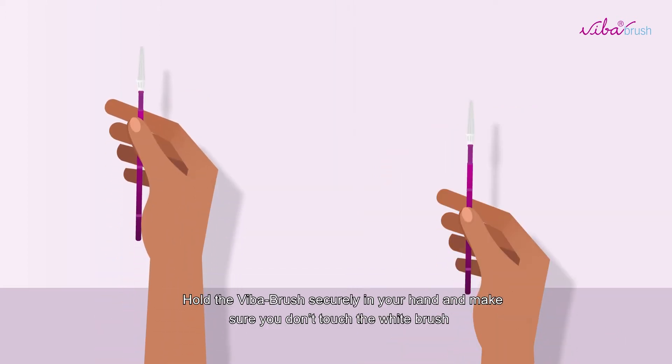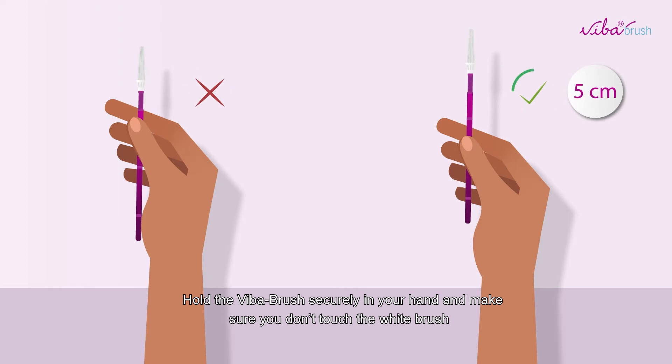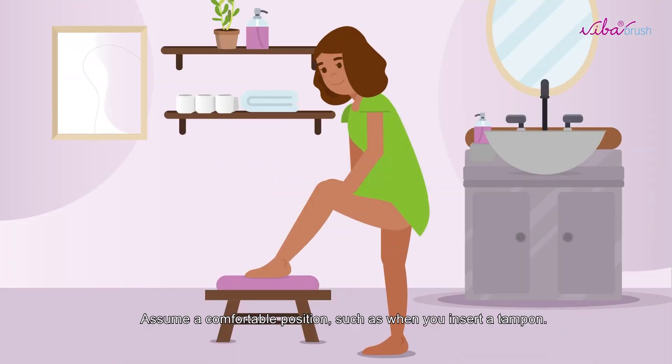Hold the Viber Brush securely in your hand and make sure you don't touch the white brush. Assume a comfortable position, such as when you insert a tampon.